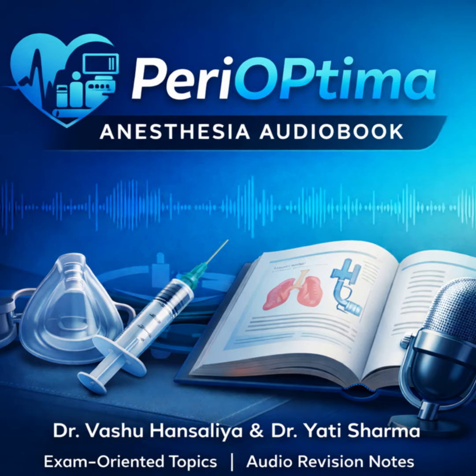And here is where you show off a bit of technical knowledge. How do we actually make those waves? You need to mention the crystal. The piezoelectric effect. I always struggle to explain this simply without sounding like a physics textbook or getting lost in the math. Think of it as a two-way street.